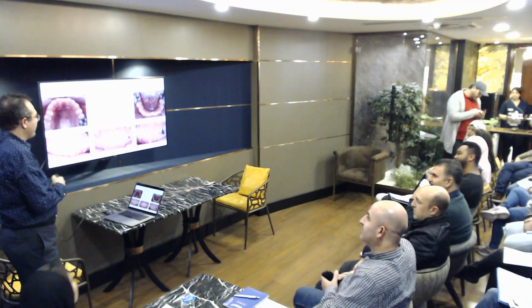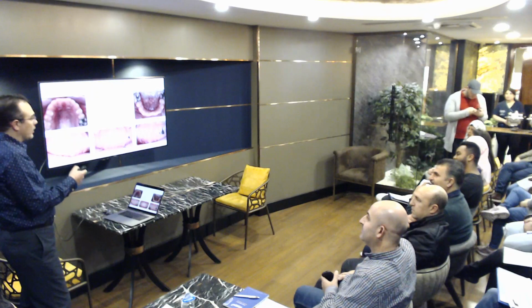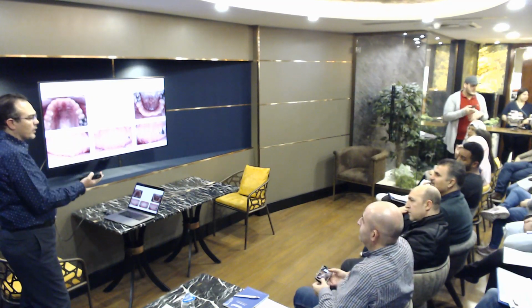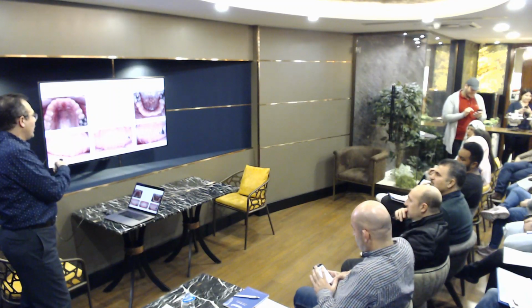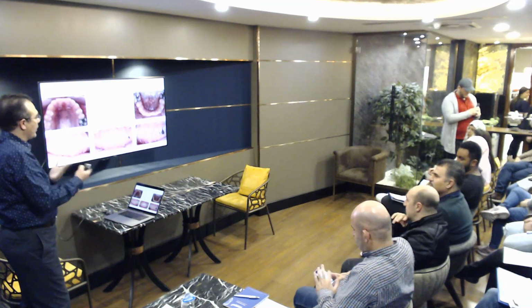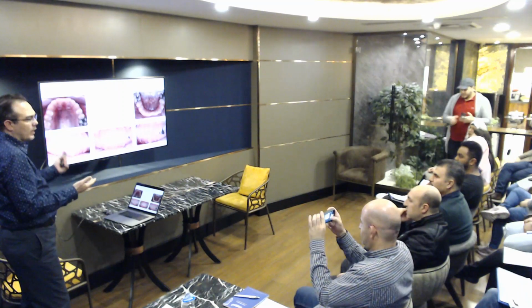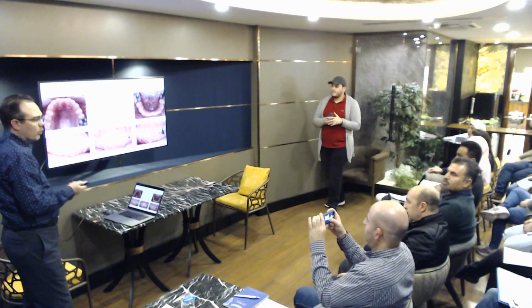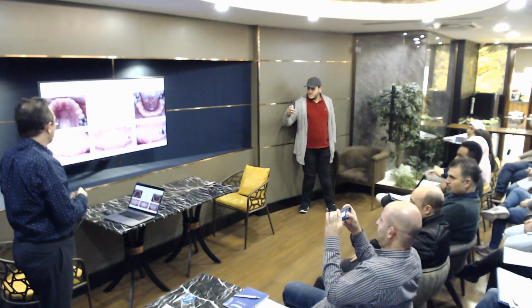the major companies would need some records so you can submit the case. We talked about it. They need intraoral photos. Just in case your scan or your impressions were not accurate, they can always refer back and match it to your photos. Sometimes, and it rarely happens now, if the records get mixed, they can refer to the photos so they would know which case or form. Okay, I already prepared that template for you. We're going to use it for the submission.